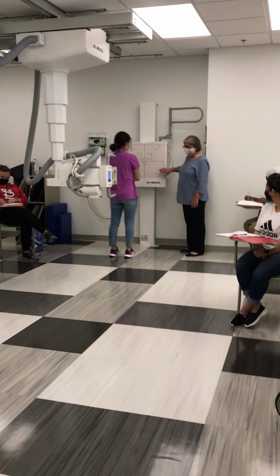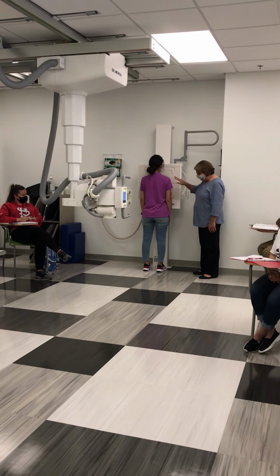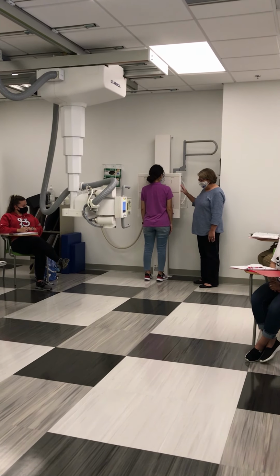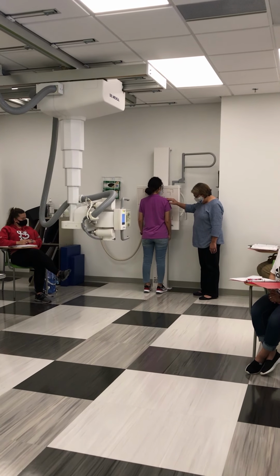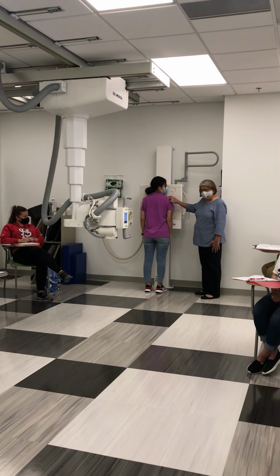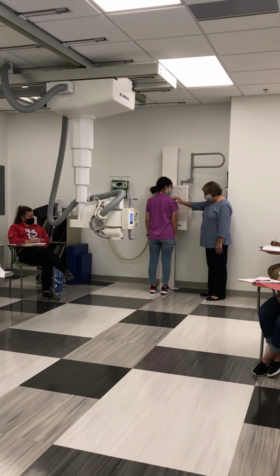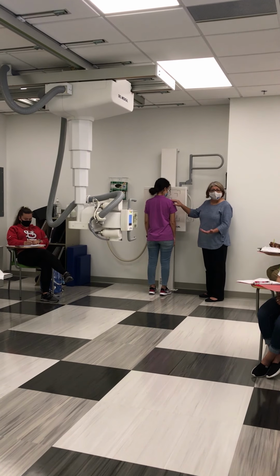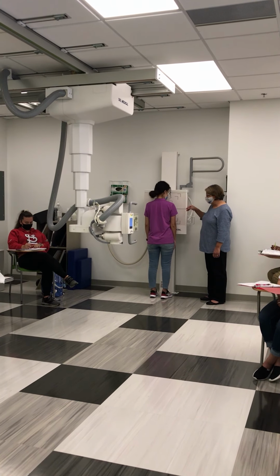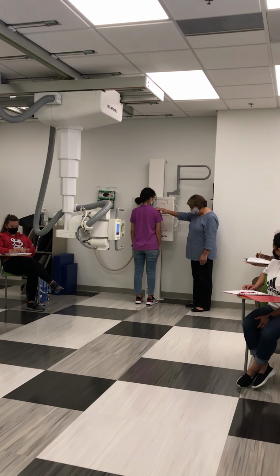Now then, ma'am, I want you to stand with your chest up against that board. Walk right up to that. Like that. We want to make sure that our patient is vertical and not leaning toward the wall bucky. So take a tiny step back. So let's say our patient was leaning and we want her closer. Or let's say that she's standing upright, but we can definitely see there's a gap between her and the wall bucky.